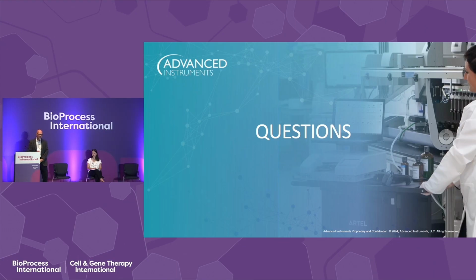But do you have a range that works really well during your assessment of this? Again, in my assessment of it, it's across the board, depending on the cells they're using. All the studies I've looked at, like I said, go from 200 millimolar up to 2 molar of DMSO. So we're from basically nothing to a very high concentration. So we would have to just do some research and see which particular cell you're looking at, and what would be the optimum solution concentration.